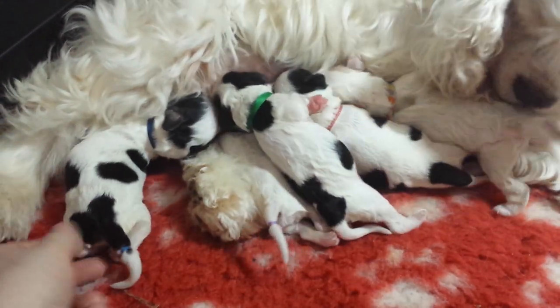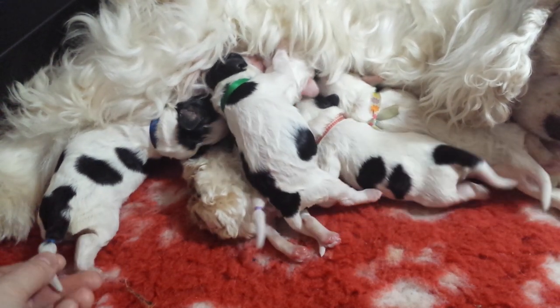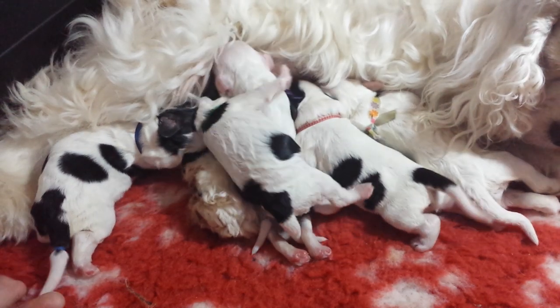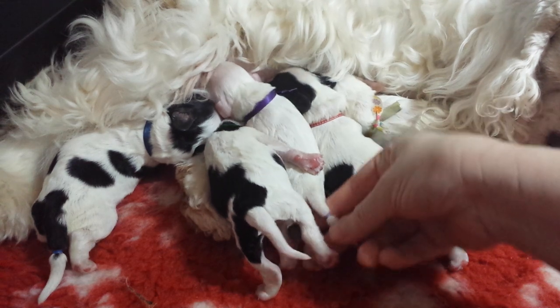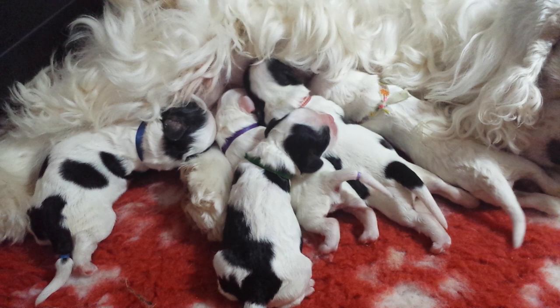As you can see — no fuss, no muss, no crying, no blood, no tears. Mom's not stressed out. Babies continue nursing the whole time. There's zero pain for the baby involved. I already docked a little purple girl's tail, as you can see. So I'll continue and do another puppy for you.